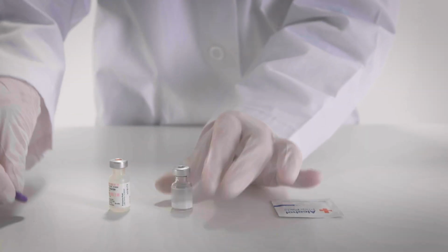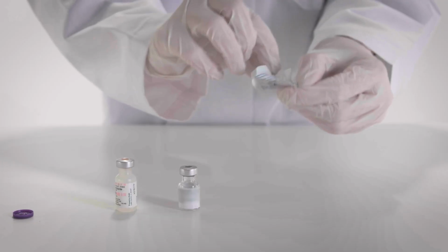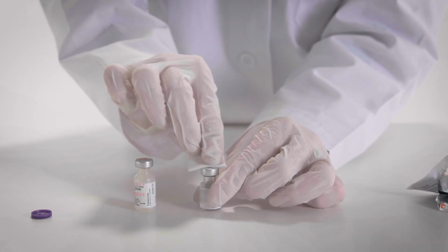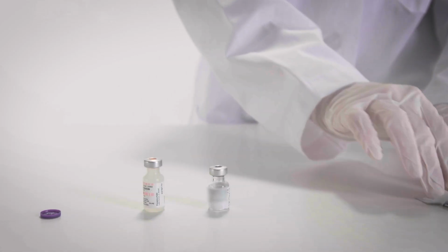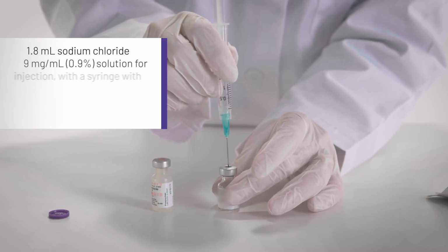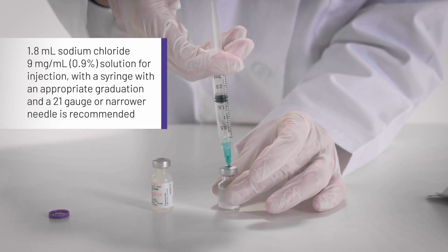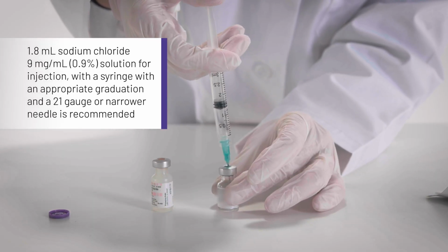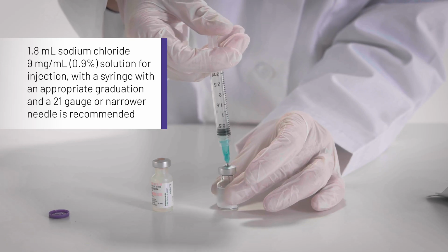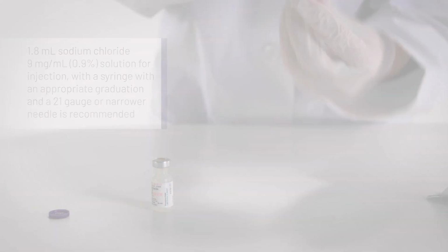Using aseptic technique, cleanse the vaccine vial stopper with a single-use antiseptic swab. Then dilute the thawed vial of the vaccine by adding 1.8 milliliter sodium chloride 9 mg per milliliter 0.9% solution for injection into the vial. Do not add more than 1.8 milliliter of diluent. A syringe with an appropriate graduation and a 21 gauge or narrower needle should be used.